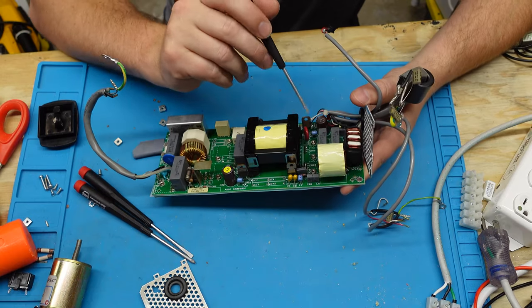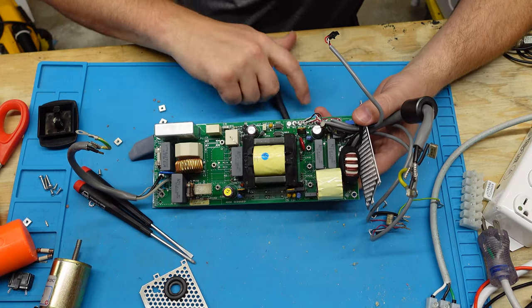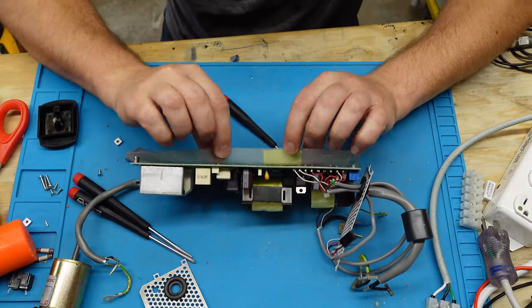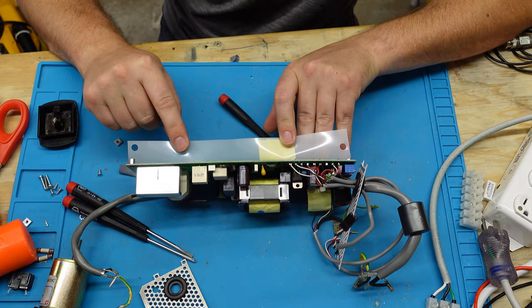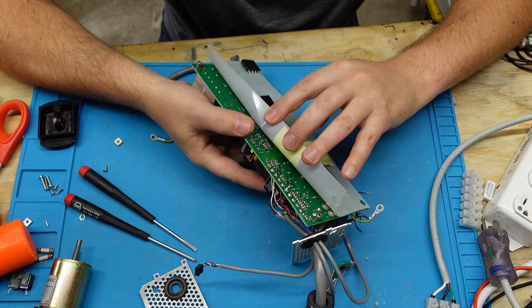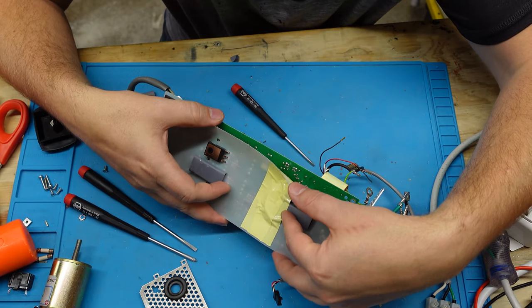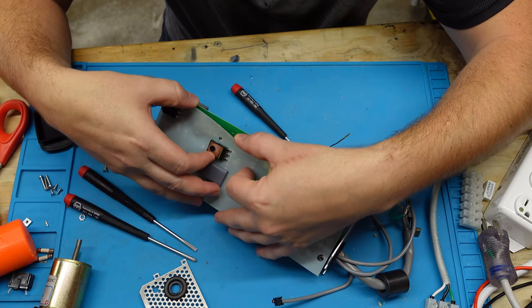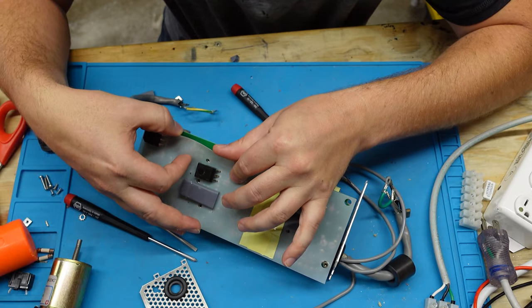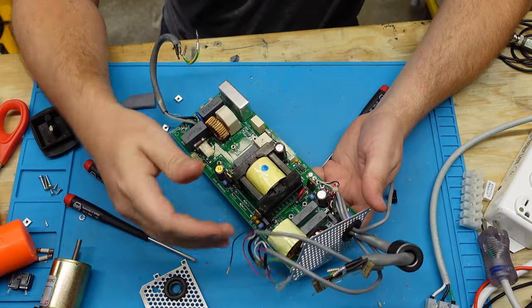Everything else on this board looks really solid. Over here on the output side, this is where I was assuming a lot of the problems were going to be, and the PCB looks good. I'm looking to see if there's any surprises on the bottom side of the board. No discoloration. There's no indicators of a lot of heat, not even around this voltage regulator. So, wow. I bet you the whole rest of this board is perfectly fine.